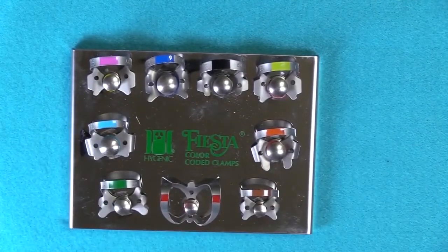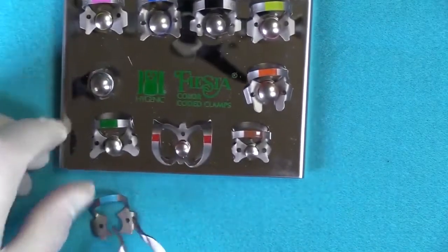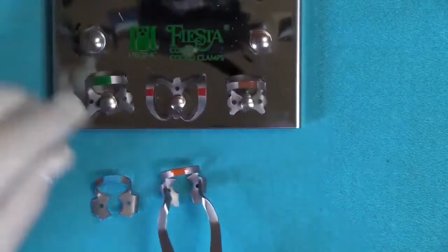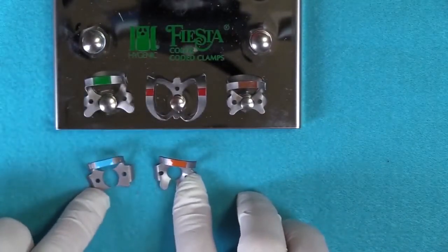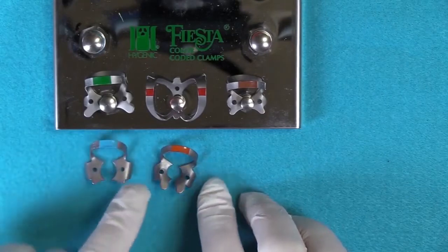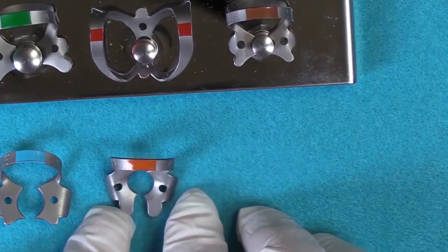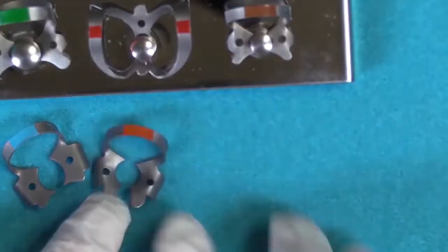As you can see, the difference between the two: this is the flat-jawed, and here's your curved or cupped jaw, and I think you can see the difference between how the jaw shapes are. As I said, flat jaws are better on the lower arch, and the curved jaws fit better on the upper arch. So you can see how that kind of dips in.